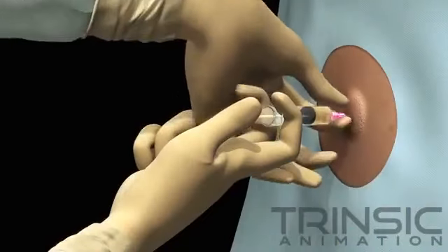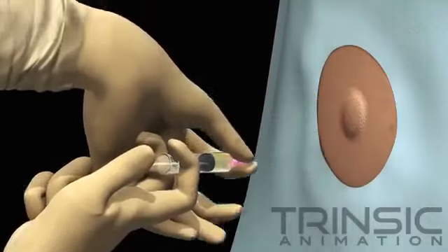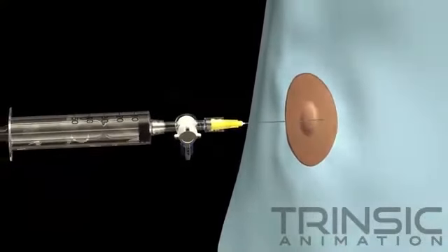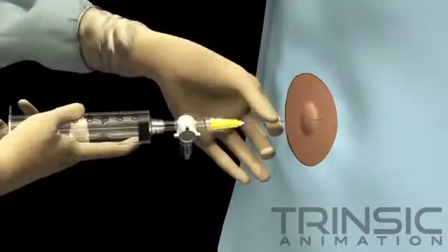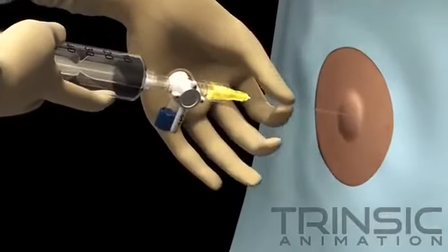Placing a sterile gloved finger on the needle at the point where it exits the skin approximates the length of the insertion for the thoracentesis needle or catheter.